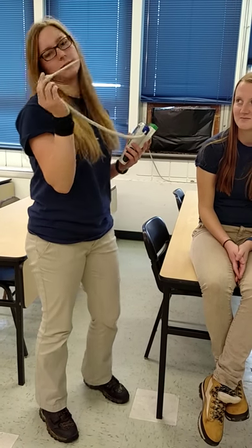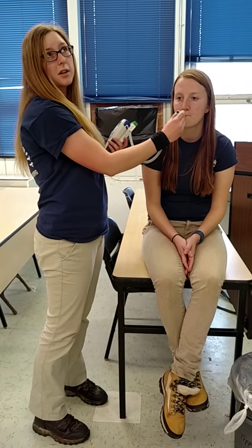There we go. And then you move the probe up to the patient to keep it under their tongue. You're going to watch — if a fever happens to be over 102, it's high grade, and below that it's low grade. She is 98.2.